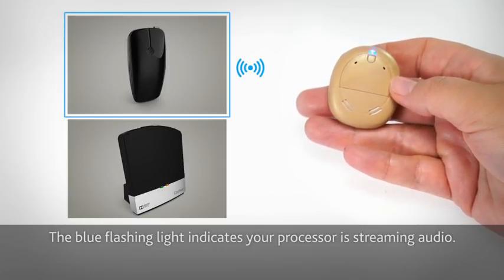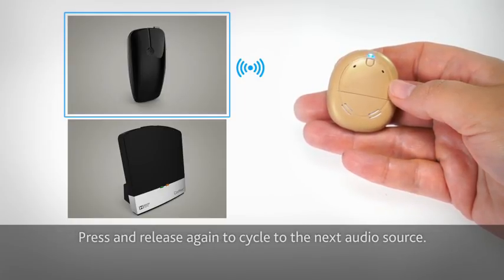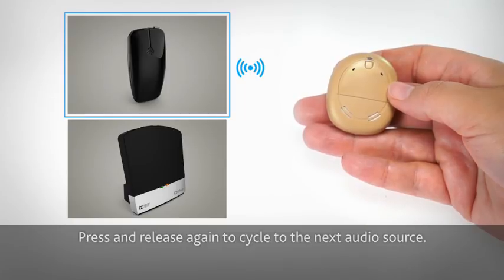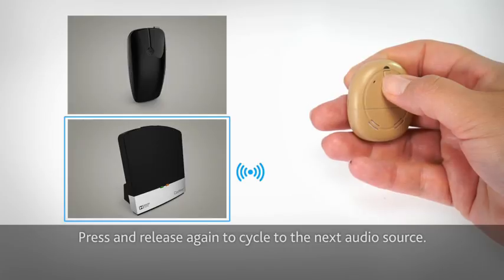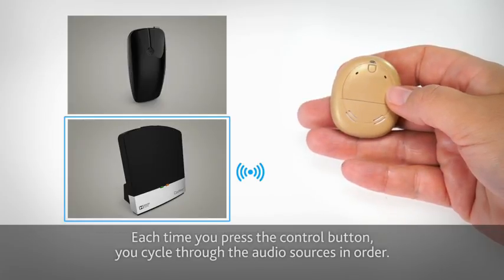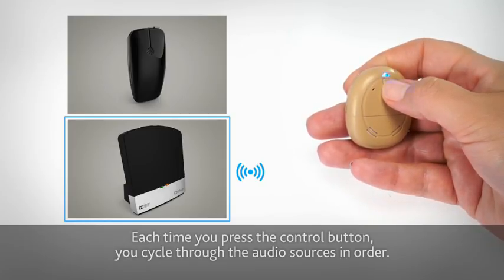The blue flashing light indicates your processor is streaming audio. Press and release again to cycle to the next audio source. Each time you press the control button, you cycle through the audio sources in order.